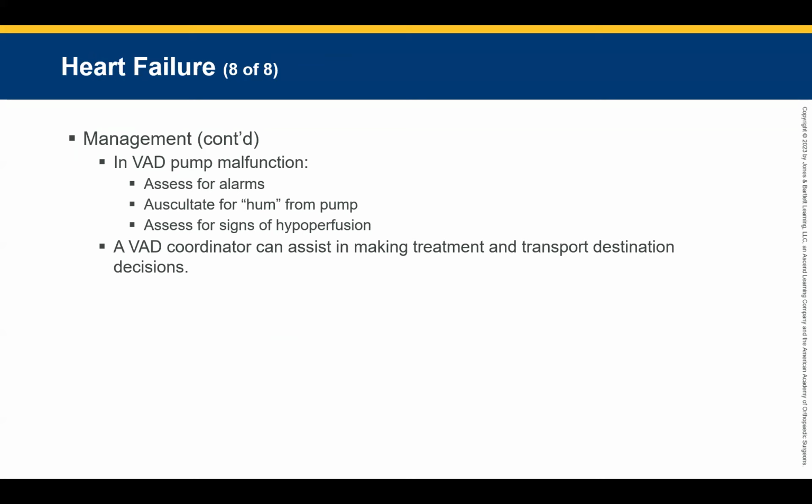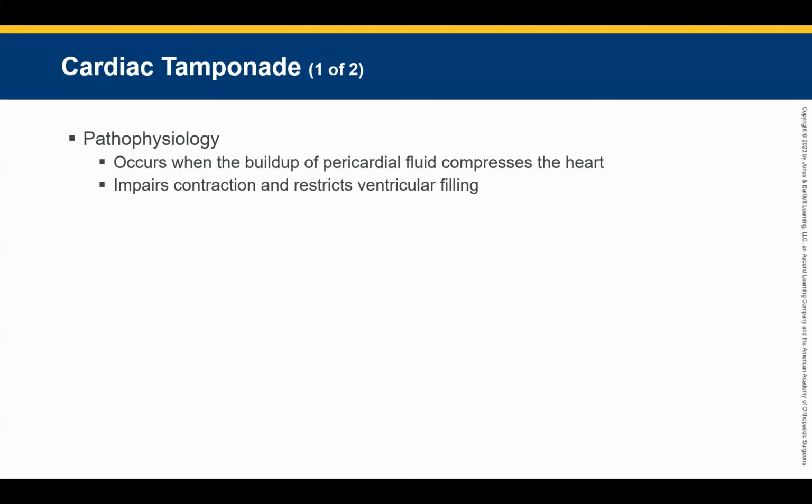Cool. You can listen for the hum of the pump. If the pump is humming, that's not the issue. So once again, auscultate with the stethoscope when you're not sure if you have a pulse. If you hear the hum of a pump, we don't need to do CPR. We need to treat other things. If you don't hear the hum of a pump, they still don't want us to do CPR, but at some point you have to because the patient's dead. Call the center, ask questions. They'll help you. There's a number on every one of them.